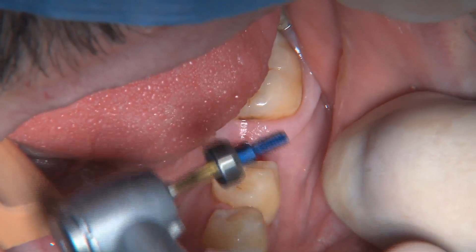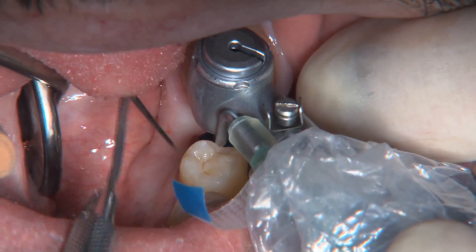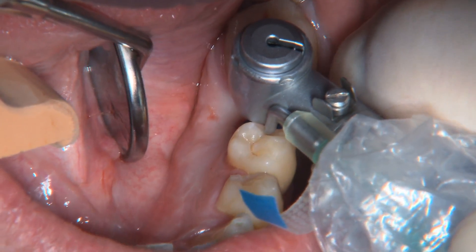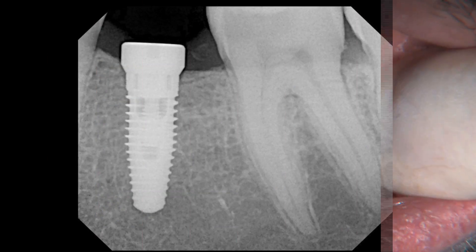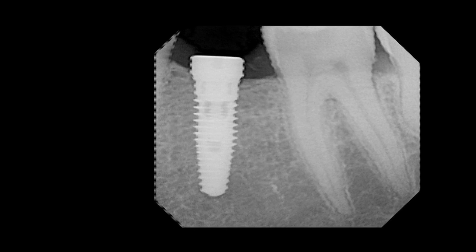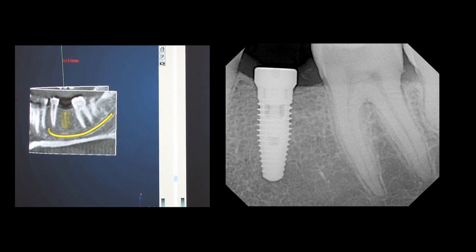Here's our first peek with the implant in place and the surgical guide out. We place the healing screw while my assistant does suction and uses a perioprobe to make sure the tissue stays clear and isn't pinched between the screw and the implant. We take a post-operative radiograph and the implant looks right where it should be. Comparing to the digital treatment plan image, it ended up right between those two teeth at the proper mesiodistal angulation — that's the beauty of the surgical guide.